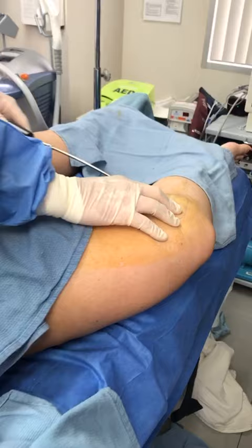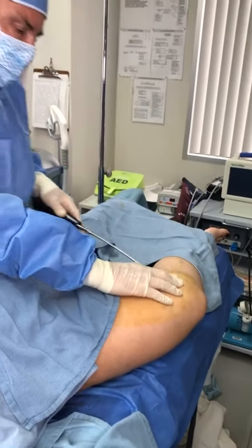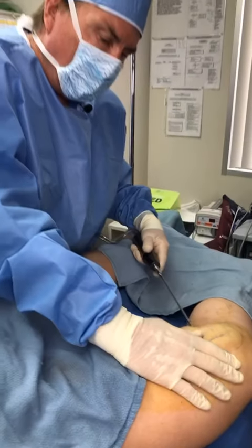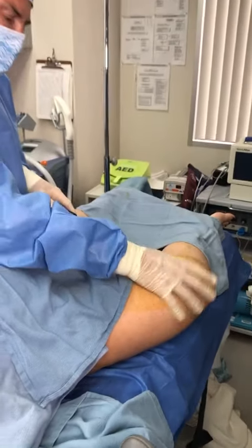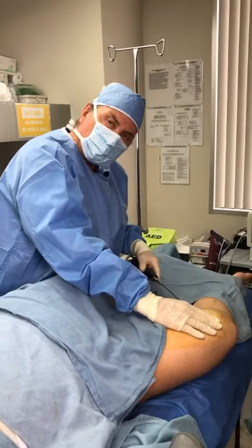It's more fun than sitting on the beach in Hawaii, huh? So this is what we're doing, and I can do tickle lipo on virtually any area of your body where you feel you have too much fatty contour.